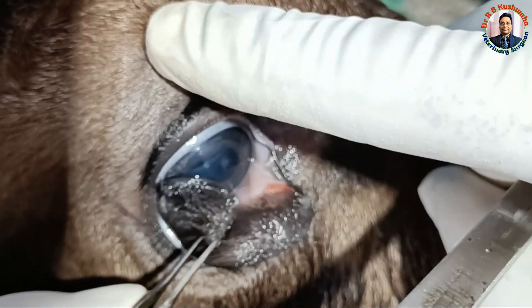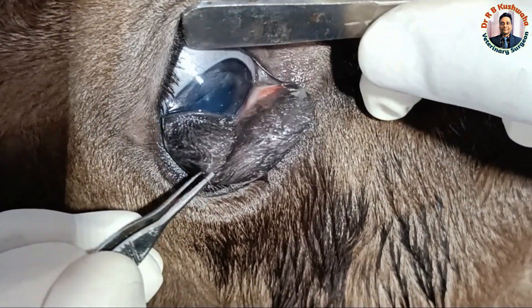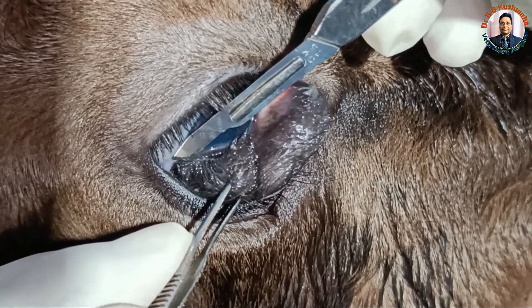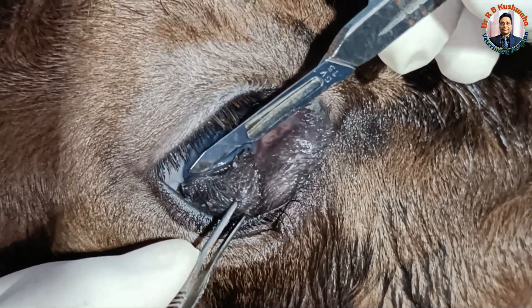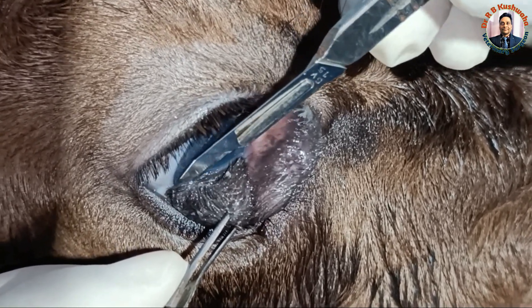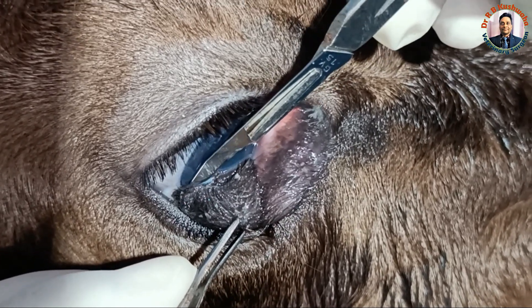If you see carefully here, this mass is attached with the cornea. So first I will separate it from the cornea. I am making a very careful incision close to the cornea.